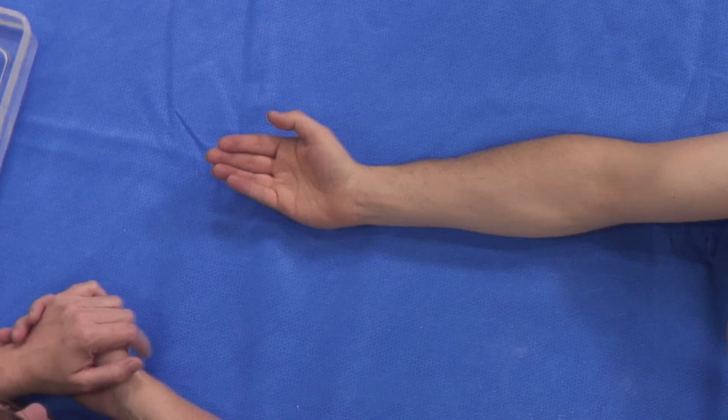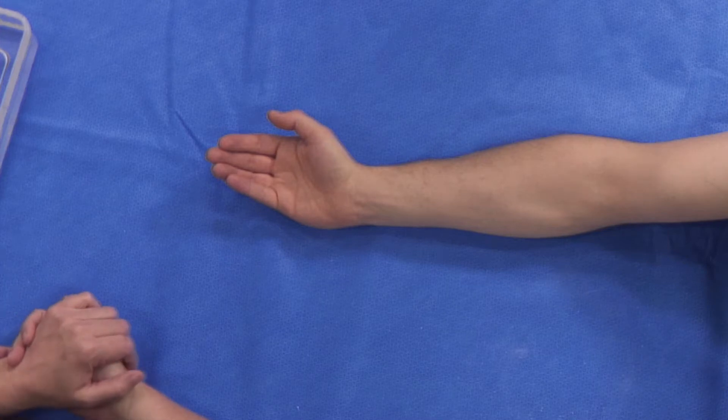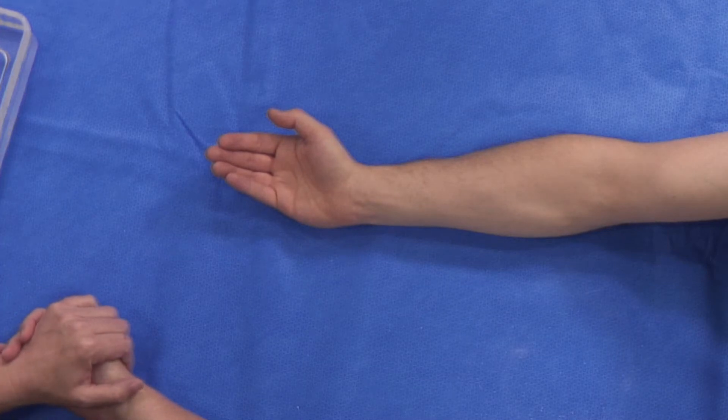This video isn't intended to be the only tuition that you have in casting the hand into the position of safe immobilisation, but it should be a good resource for you as a reminder.